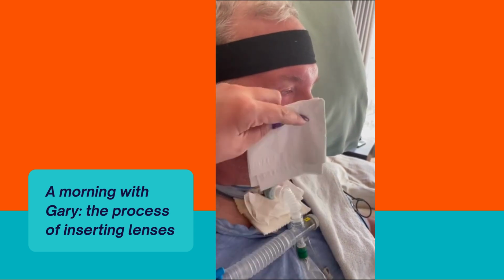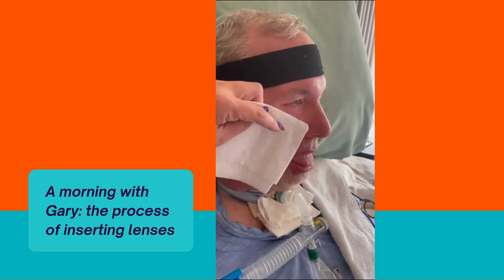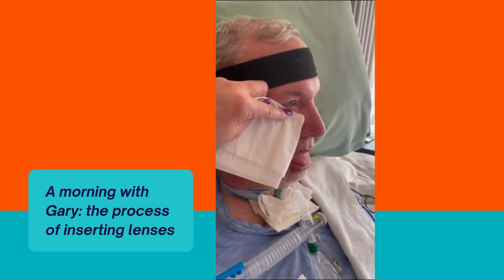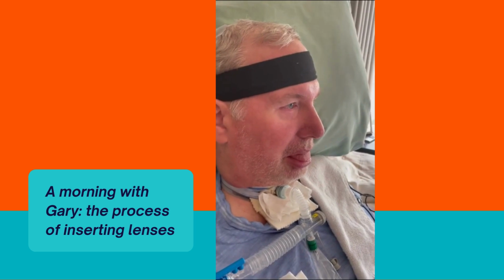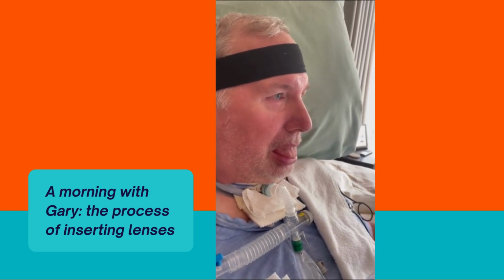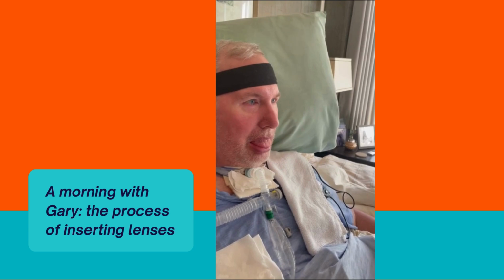So she did that super easy. It's not easy the first couple times. Relax. It does take time to get used to, but once you do it. And then she kind of tilts it up and in. And you're trying to tilt up and in fast enough, but not too fast. Slow, but not too slow, to be able to get it in without getting bubbles in it. So now we're going to check to see if Gary has a bubble. Usually this is very up close and personal, and I just kind of lean in and open the eye.